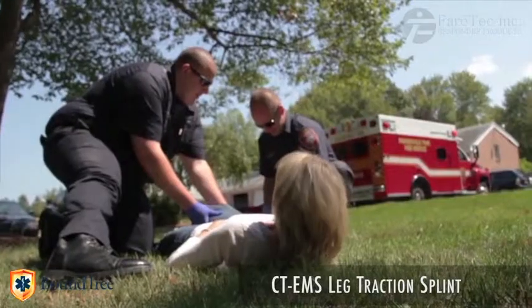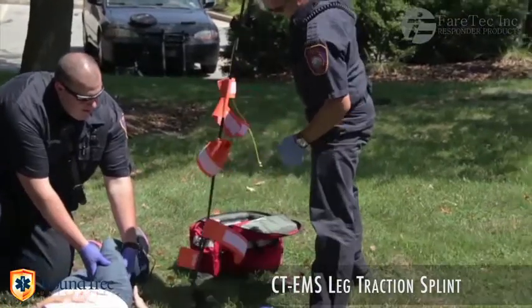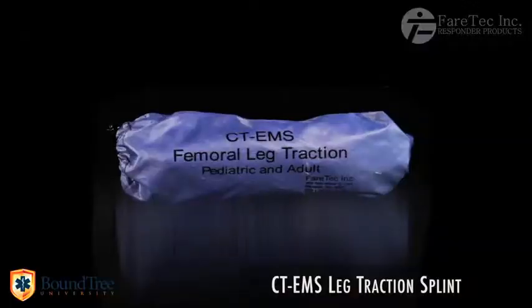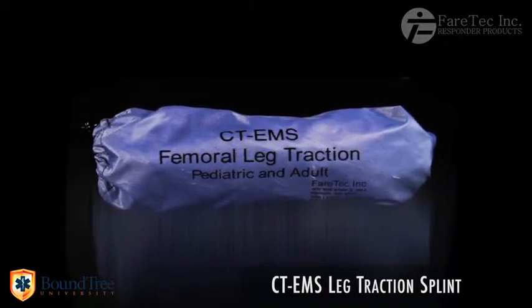The goal was to create a splint that was light and compact, rugged and extremely functional for all-sized patients during critical situations. The CT-EMS weighs about one pound, measures 11 inches in length, and has a diameter of 4 inches.